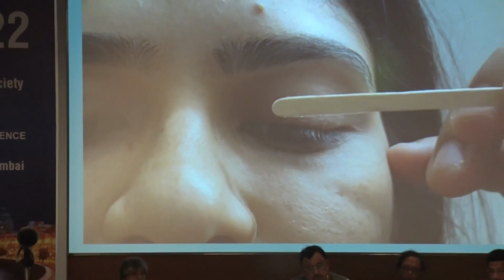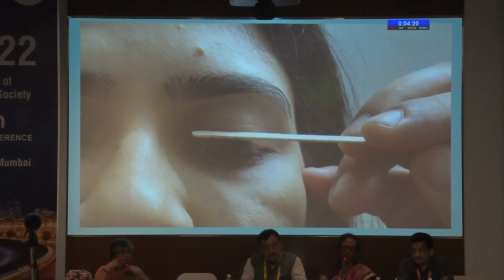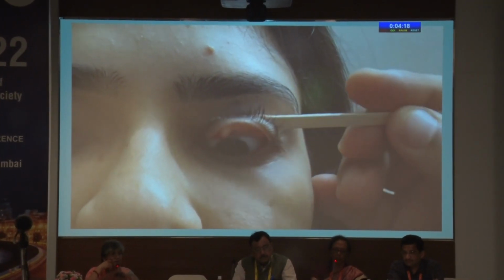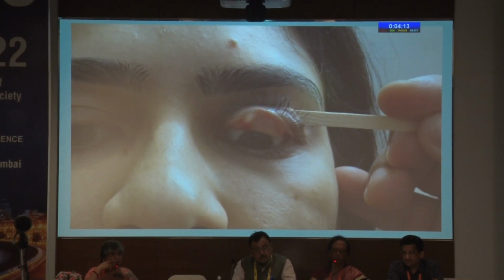The video shows the application. We place the iVerter at the margin of the lid and we just twist it, and we can see how beautifully it can expose the upper tarsal plate.